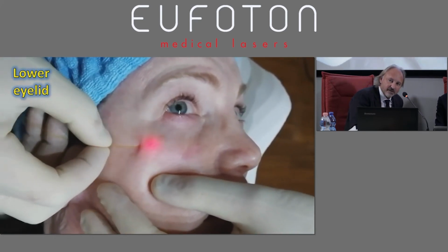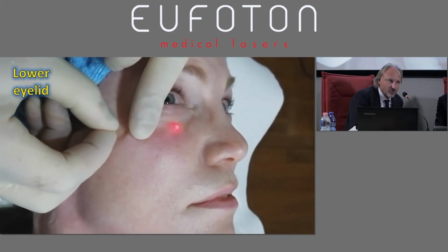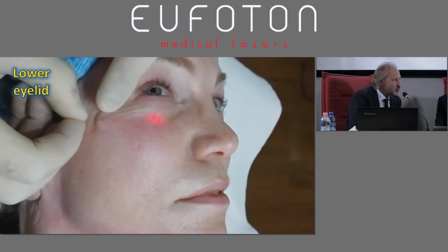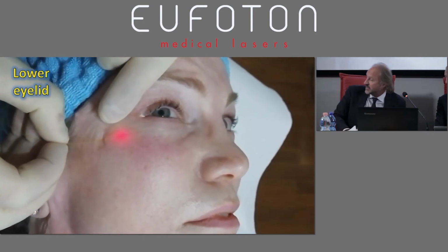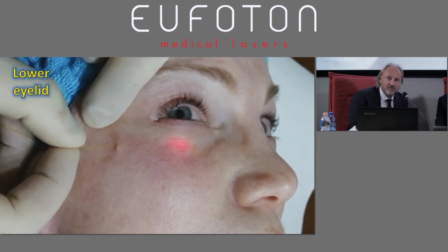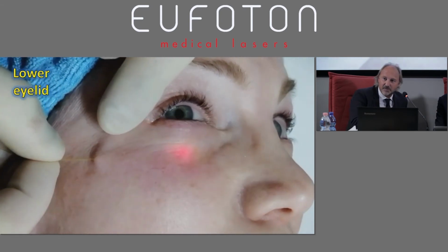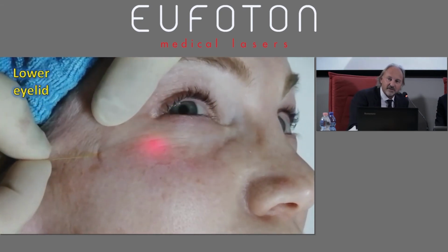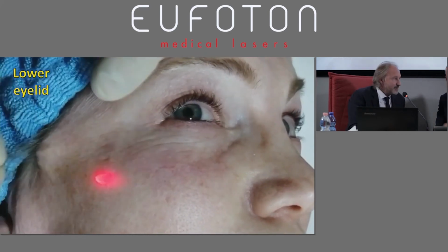The cases of breakage in my series belong to my very first period. I know a huge work has been done on the production of fibers, because in my view these fibers are very well structured. They are very, very strong. Since we had this huge change, we didn't see any broken fiber. Never reported.